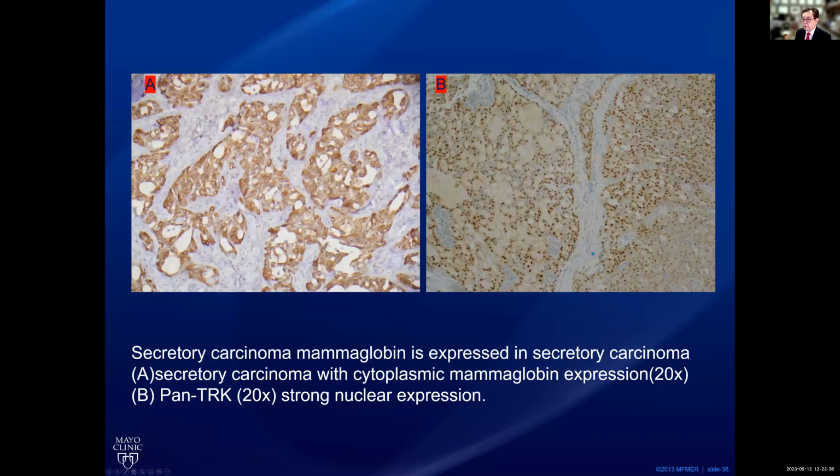And as we know, FISH is not that difficult. However, not every lab will be able to do it. It takes a longer time and more expertise. And if we can use immunostain to translate the genetic mutation information, that would be ideal, right?